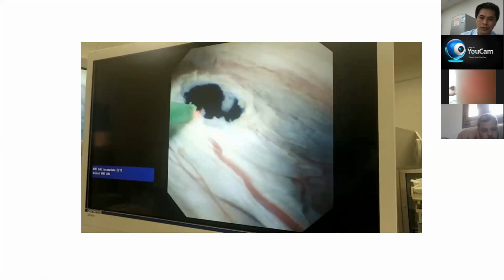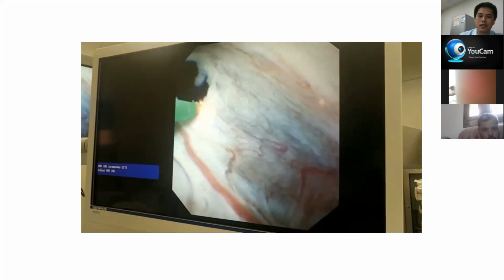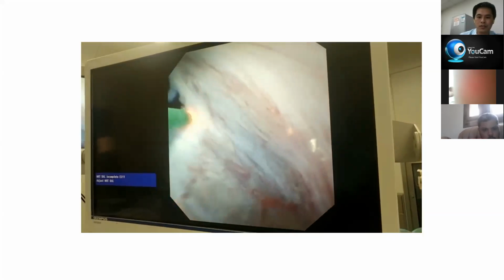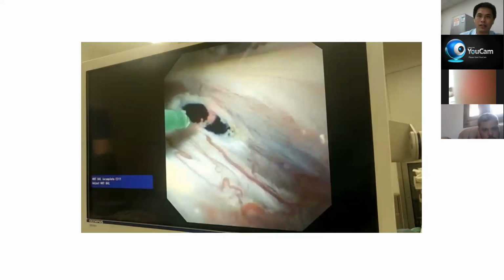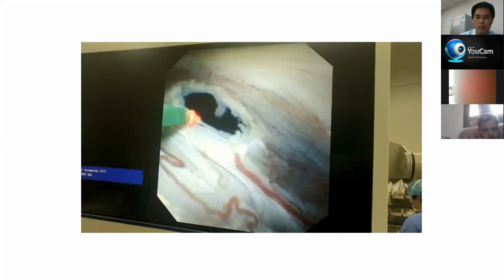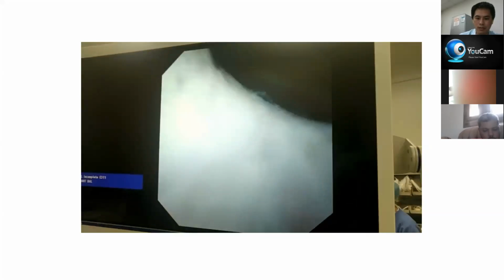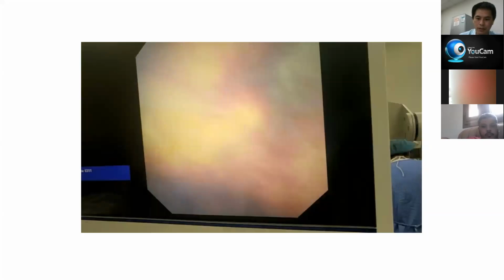The whole of the cut we make on the cyst should not be too much. It's enough for you to move in the scope, about 2 centimeters at most. I think 1 centimeter would be enough for the cut. Then we can go inside and check the cyst wall and if there's a stone inside the cyst.